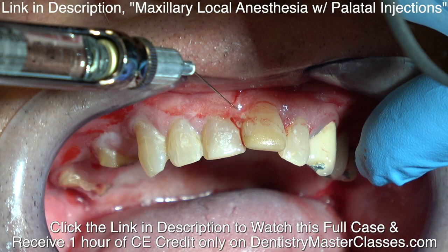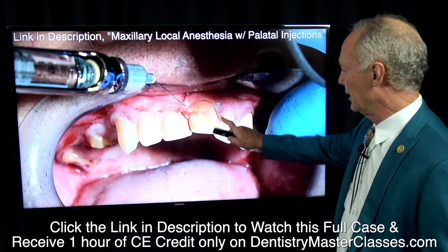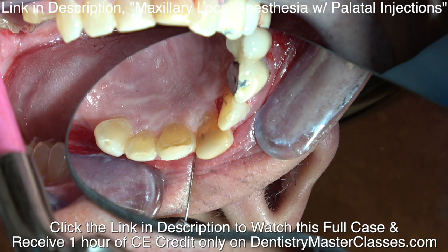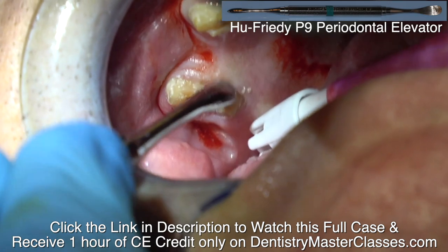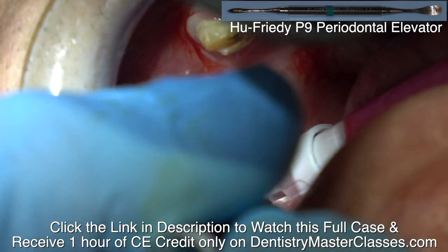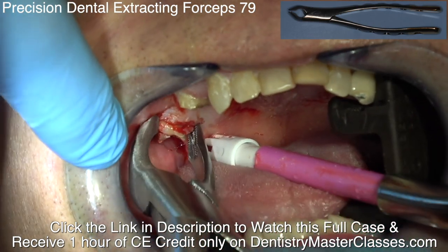When you're anesthetizing the incisive nerve, don't ever anesthetize straight into the palate — that patient will hate you. That's the most painful injection of all. Anesthetize the facial first, then come through the papilla between the incisors and blanch the tissue on the palatal. Then you can go to the palatal and anesthetize the incisive nerve. I'm also anesthetizing the greater palatine nerves. You can watch my videos on how to anesthetize nerves in the palate.